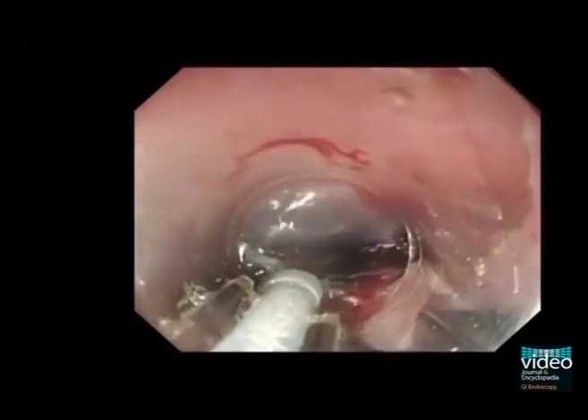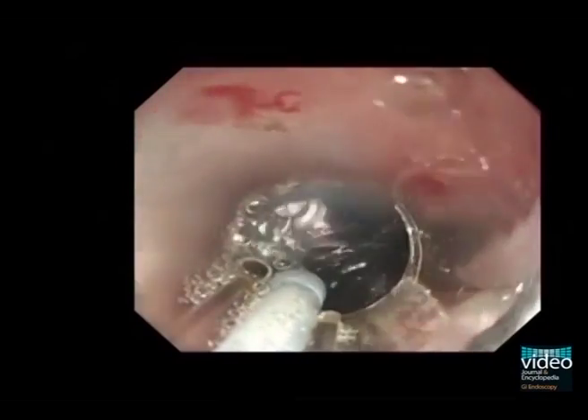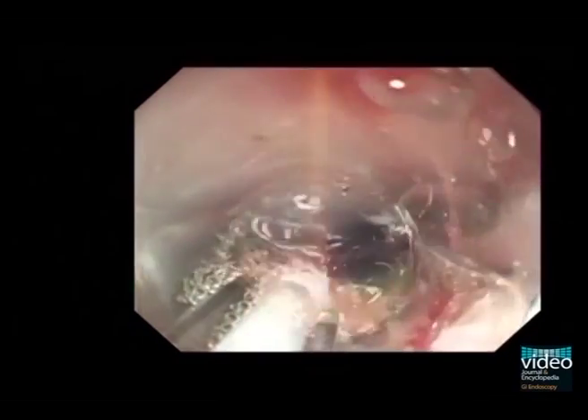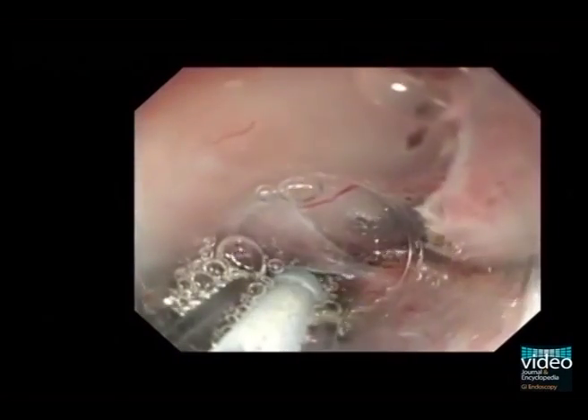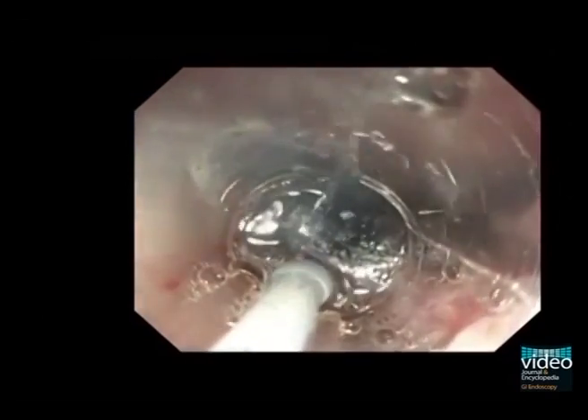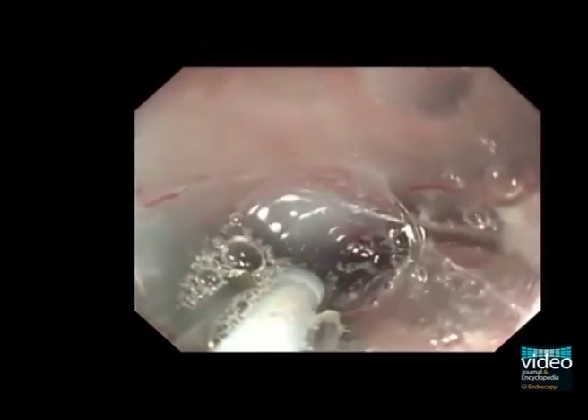The submucosal dissection was performed step by step. Using the small calibre transparent hood, we can see the submucosal layer and move the knife in any direction. We do not have to cut the submucosal layer — all we have to do is touch the submucosal layer with the knife, because the submucosal layer is always stretched by the small calibre transparent hood.